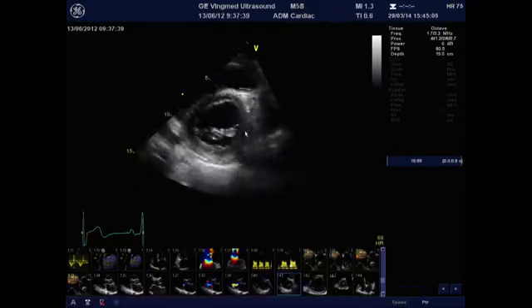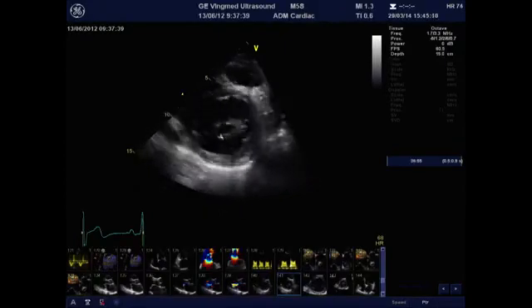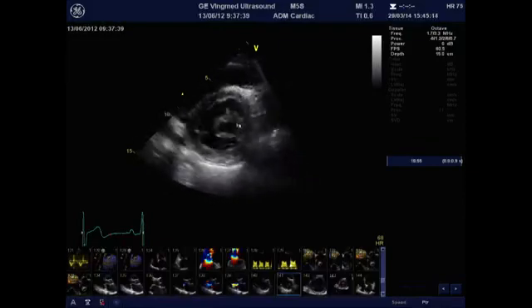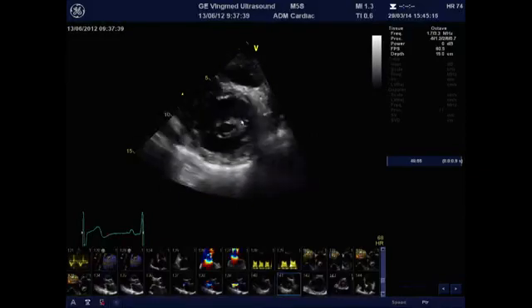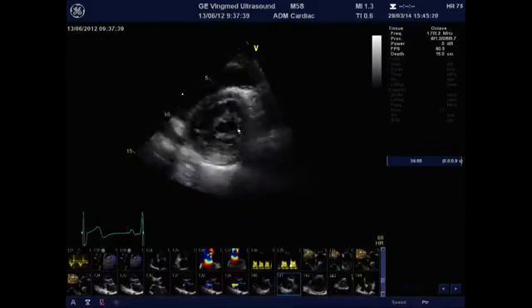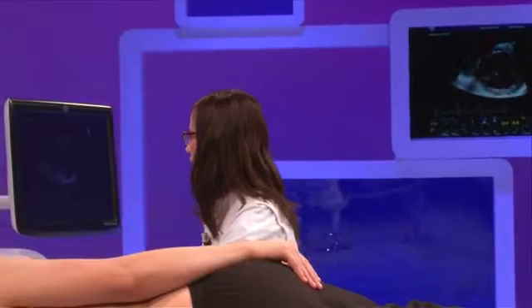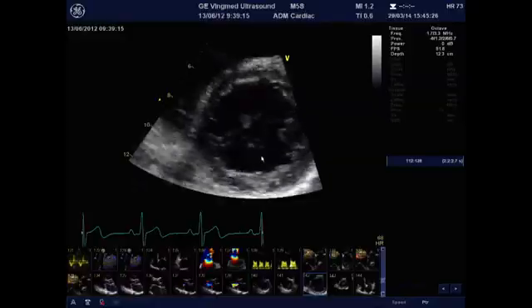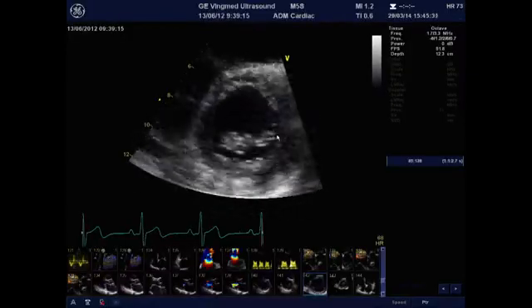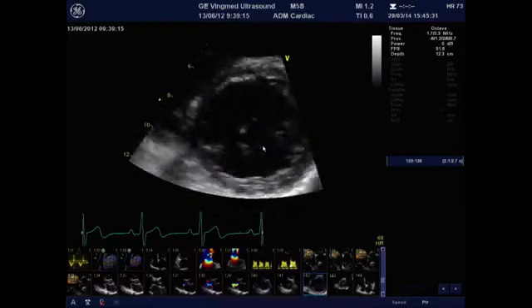Here, this patient does not have any important calcification of the mitral leaflets because we would have seen reverberation and shadowing, but it has, however, a mobile anterior leaflet, the fused commissure, and very thick leaflets. If you further zoom on the valve, you can see again the same aspect. The fused commissures are really nicely seen, and the opening of the mitral valve.